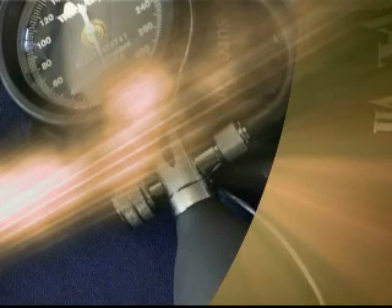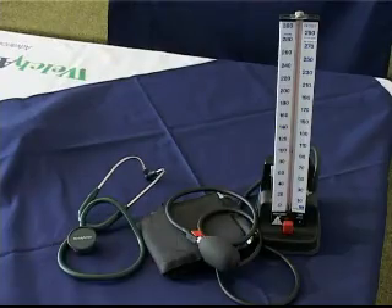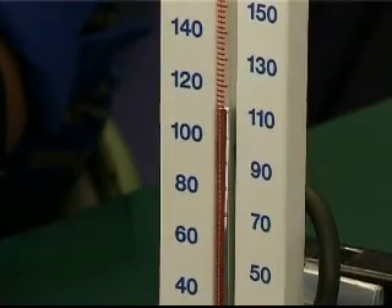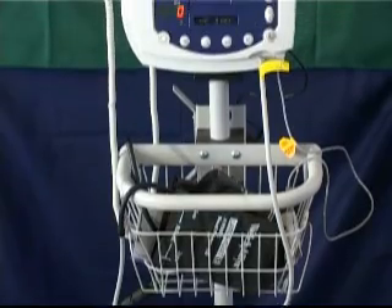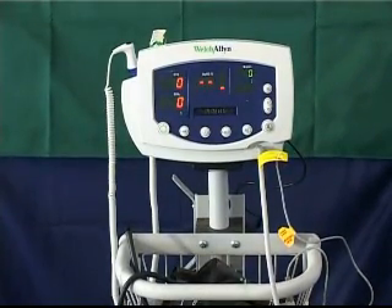There are three main types of sphygmomanometers: mercury type, aneroid or dial type, and the electronic blood pressure meter. For this training module, a mercury table model sphygmomanometer will be used. Other types of blood pressure meters will also be shown so that users will become familiar with their applications.